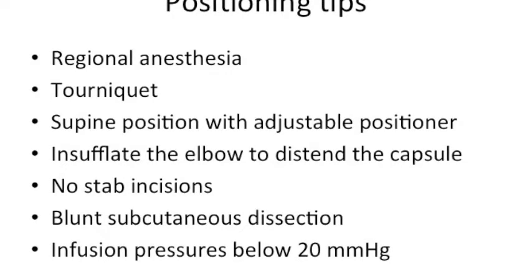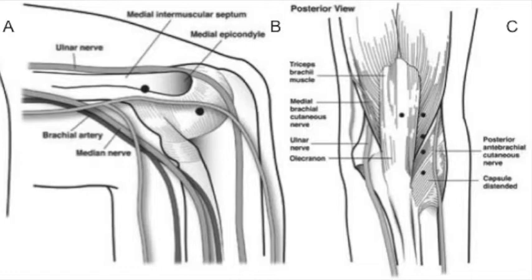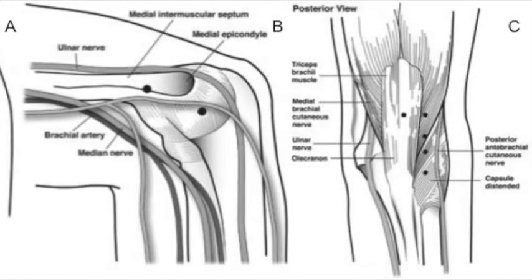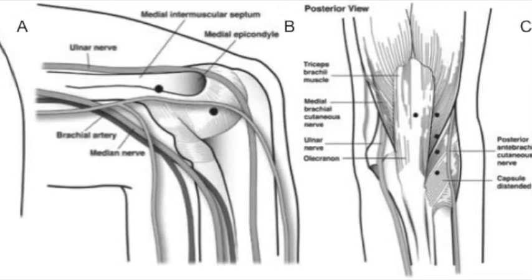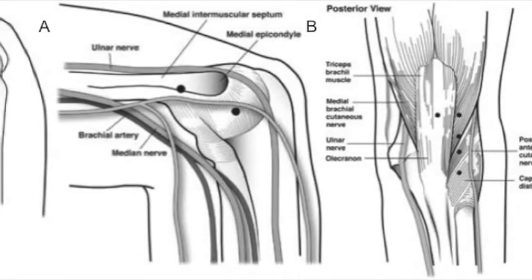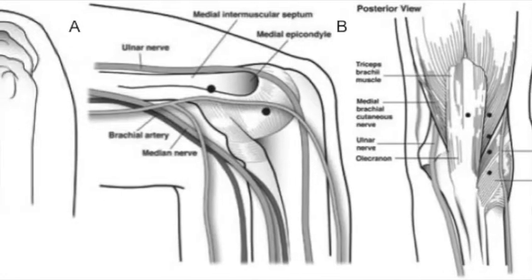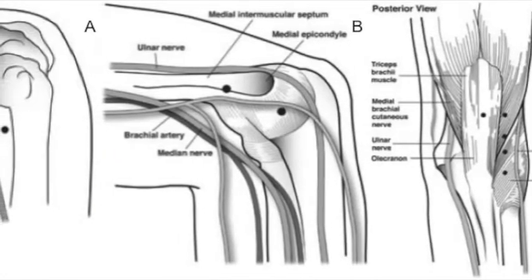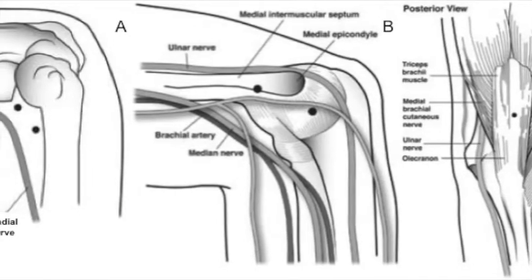During arthroscopy, infusion pressures below 20 millimeters of mercury are used. This permits extending working time without distending the elbow. A proximal anteromedial portal is created using blunt trocar technique. This portal is often used as a starting point in elbow arthroscopy and offers an optimal view of the entire anterior compartment. It is made 2 centimeters proximal and 1 centimeter anterior to the medial epicondyle to avoid injury to the ulnar nerve. When making the portal, a blunt trocar should be used to pierce the flexor pronator mass.